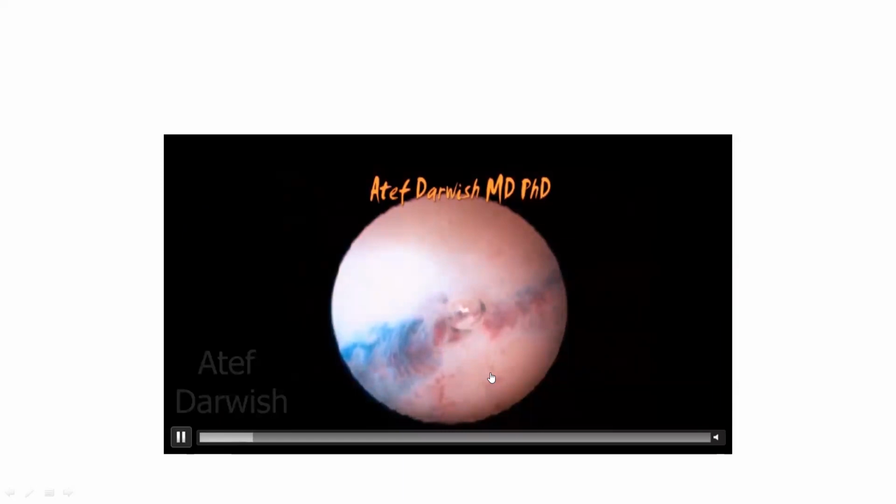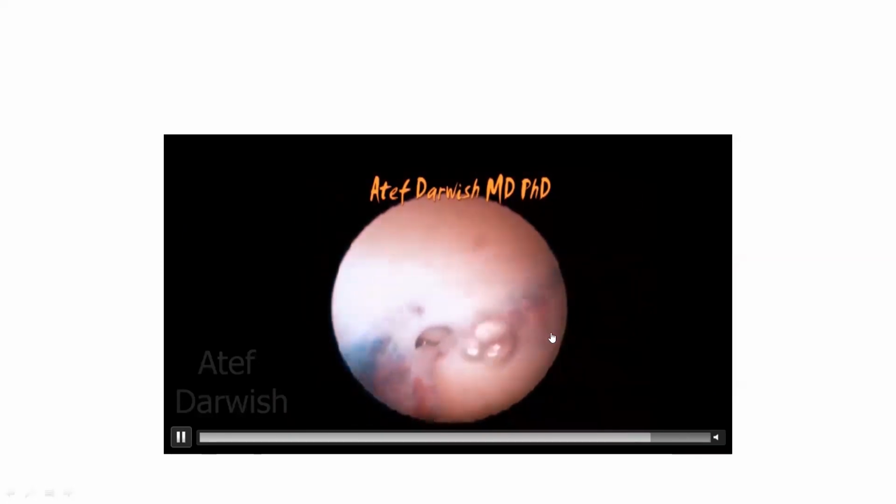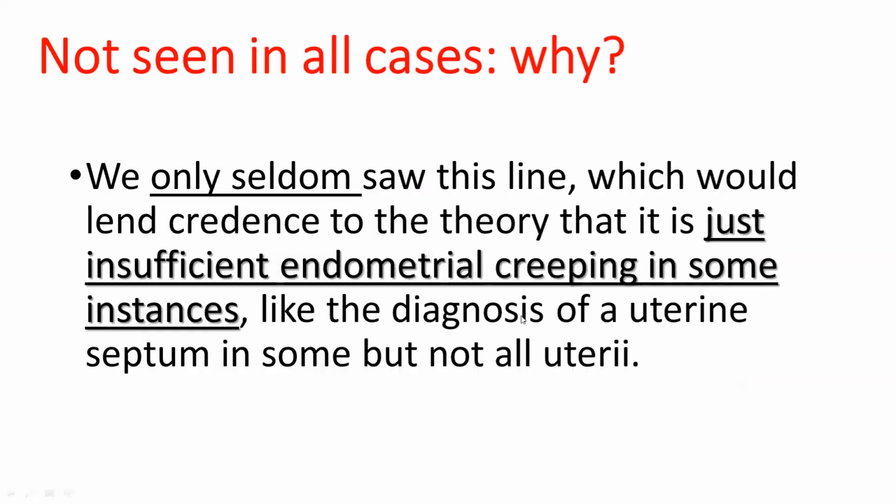Here, in this case of a negative bubble flow test, you can see methylene blue staining of this line of the fundus, and of course the fundus is extending to this part and takes the methylene blue dye due to defective endometrium. All these and other photos signify that this finding and observation should be considered.